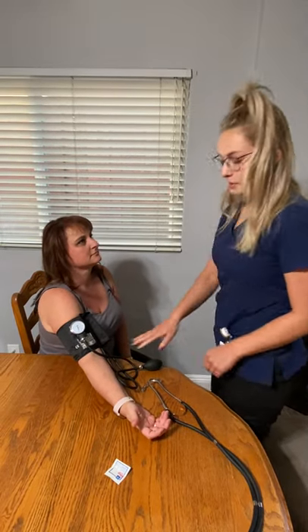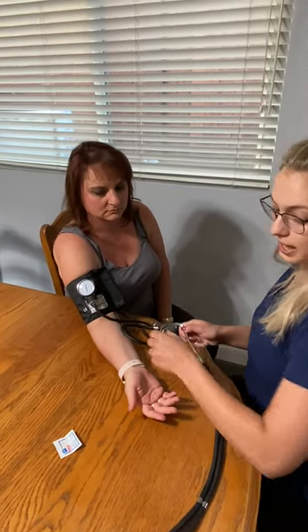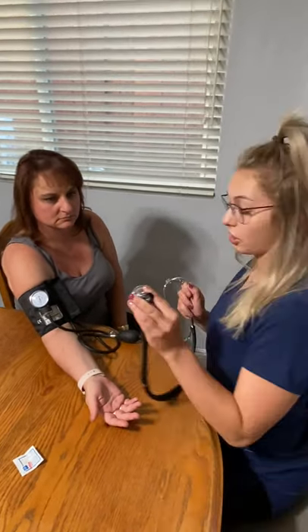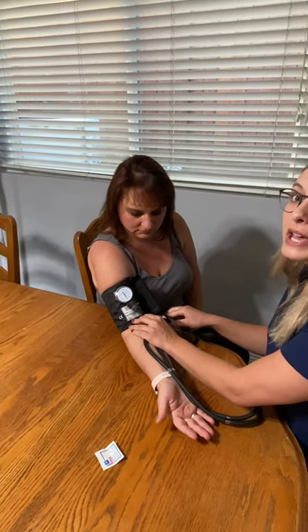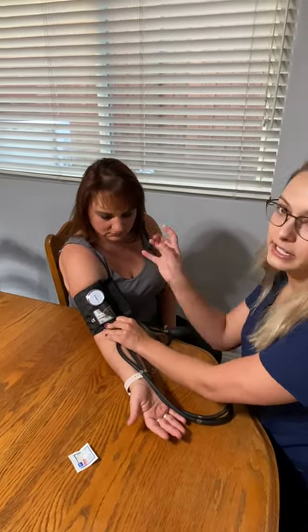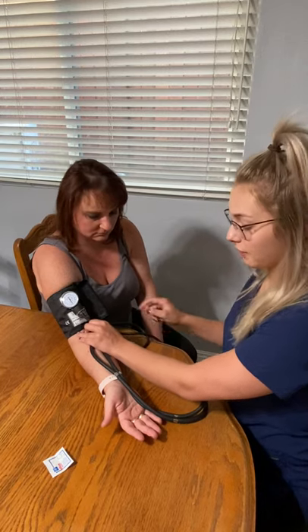Her arm is resting on the table, her feet are flat on the floor, and I'm going to sit down as well. One thing I see a lot of students do wrong: when placing the stethoscope on the artery, make sure it is not under the cuff — that is a big no-no, because the sound gets trapped and you may hear thuds that are actually you making contact with the blood pressure cuff.